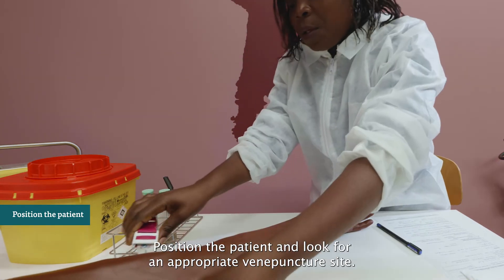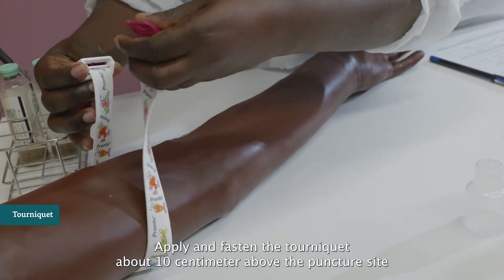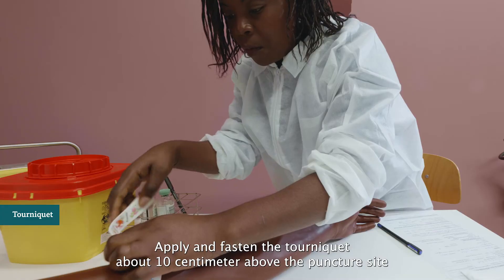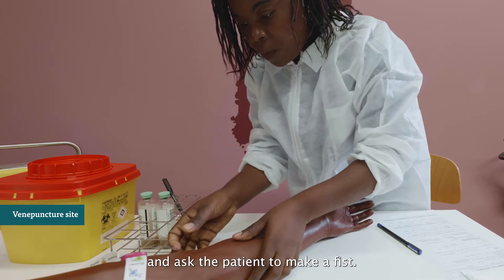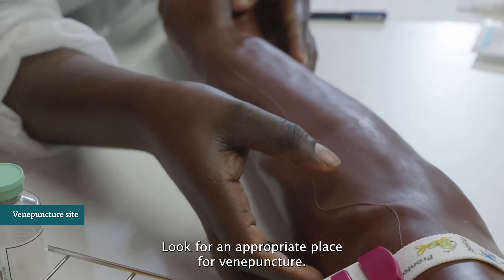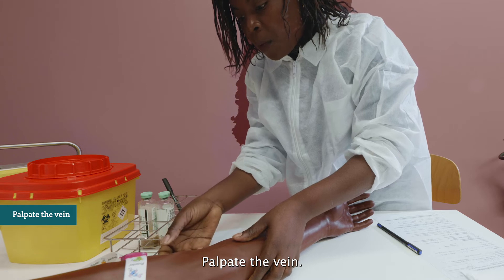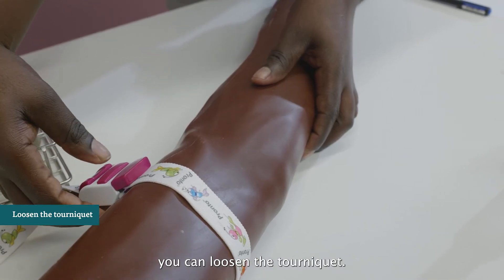Position the patient and look for an appropriate venipuncture site. Apply and fasten the tourniquet about 10 cm above the puncture site and ask the patient to make a fist. Look for an appropriate place for venipuncture, palpate the vein, and once you have identified the vein, loosen the tourniquet.